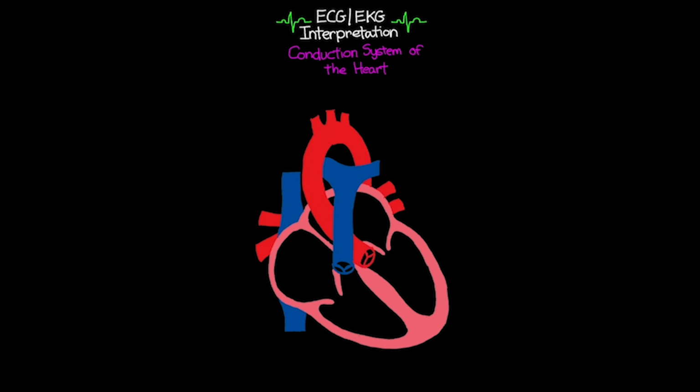And so I'm going to go ahead and label some parts on here so that we make sure we're looking at this in the same way. The first thing I'm going to label is our right atrium, our right ventricle, our left atrium, and our left ventricle. Now, as we know, these are the 4 major chambers of the heart, and the blood flows through these chambers out to various parts of the body.